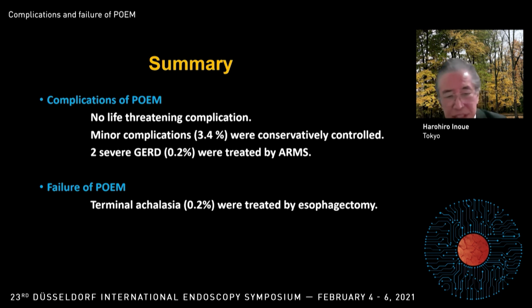Two patients developed severe GERD. First we performed an ARMS procedure, but now we recommend the POEF procedure, because the patient's esophagus has no peristalsis because of achalasia. Failure of POEM may happen in 0.1 to 0.2%, and these patients should be treated by esophagectomy. This is my summary. Thank you very much for your kind attention.